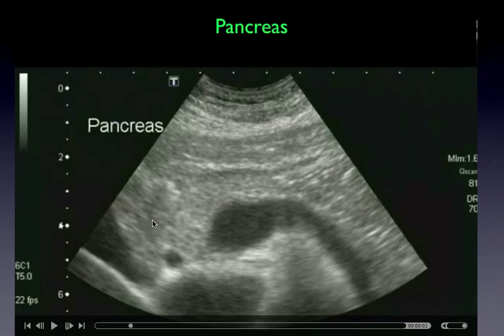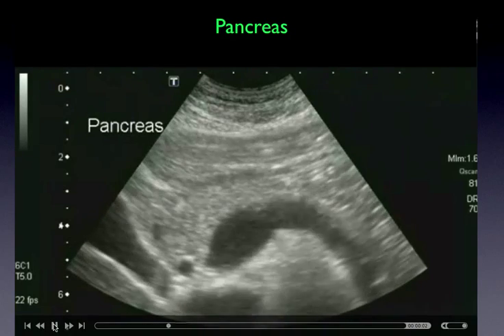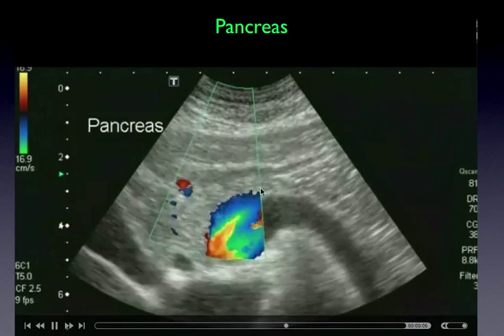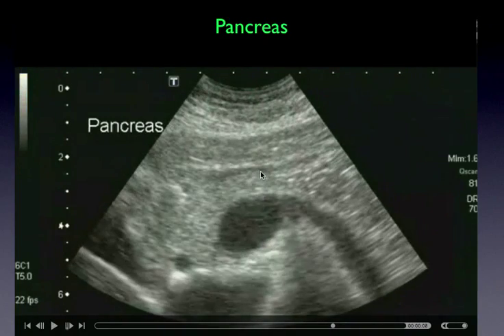This, you can actually make out the edge of the pancreas here. So what's in this direction? We know duodenum's over here. We know spleen is over here. Up here is stomach. So this is coming from the stomach, I believe. And now we'll see again vascular. Well, they were thinking the duct isn't vascular, but neither is the stomach.